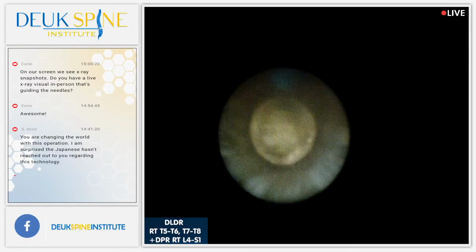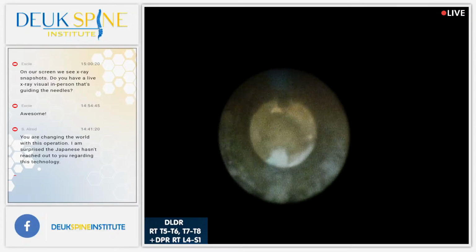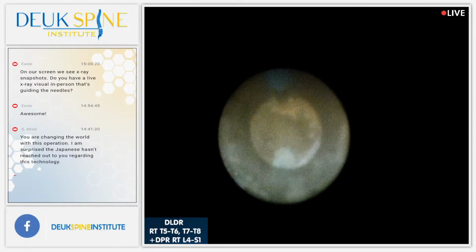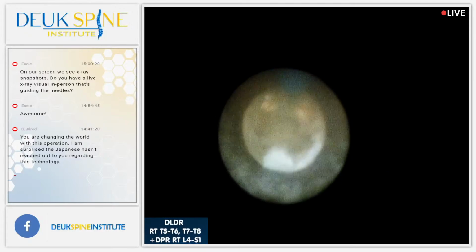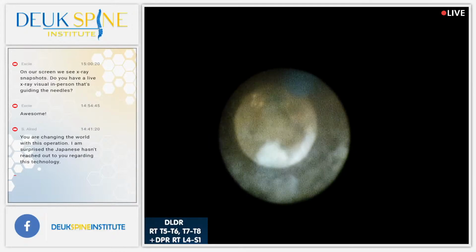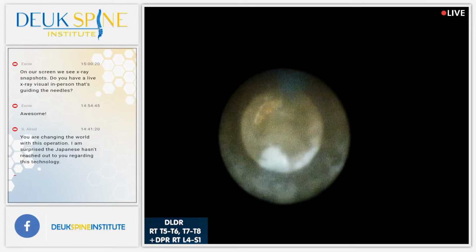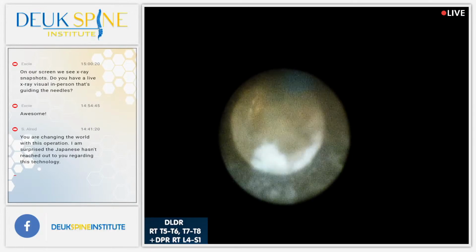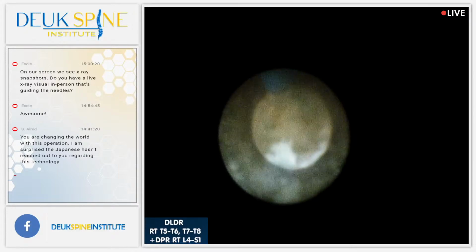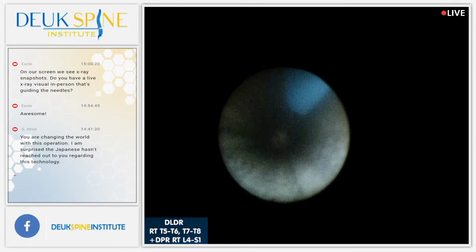All right, any questions? Yes, we have a question from XC once more on YouTube. They asked, on our screen we see X-ray snapshots. Do you have a live X-ray visual in person that's guiding the needles? Great question. No, I use the X-ray snapshots that you get. Everything I see, you see. I'm showing you everything the surgeon sees. So those X-ray snapshots are what I use. There's no continuous video feed for X-ray.